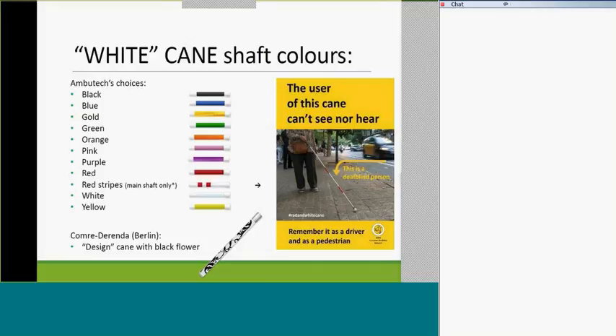Colors are huge. The funky flower-pattern one at the bottom is from that Berlin site in Germany, while all the ones above are what Ambutech offers — combinations of black, blue, gold, and others. The one with two red stripes mid-shaft is notable: in some countries, including the UK and parts of Europe and Spain, two red stripes on a cane identifies the user as deaf-blind. In some other places, an all-green cane means low vision — I think that was Brazil or somewhere in South America.